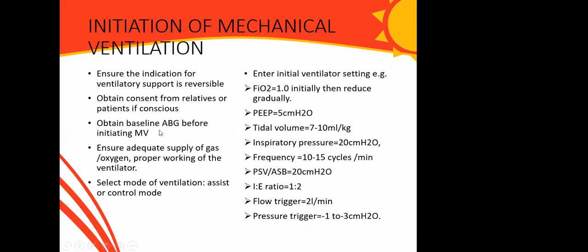Before you put a patient on a ventilator, you must obtain your baseline arterial blood gases, because it will determine the settings you will feed into the ventilator. Ensure adequate supply of gases and oxygen, and proper working of the ventilator.